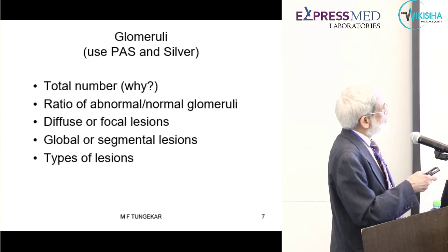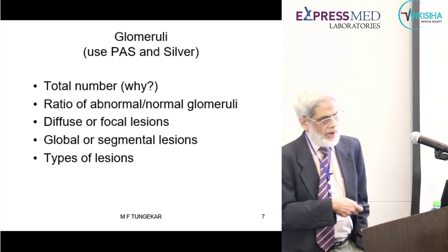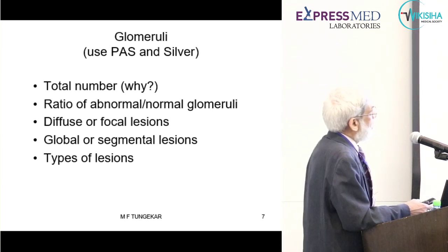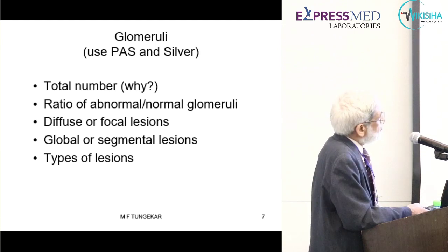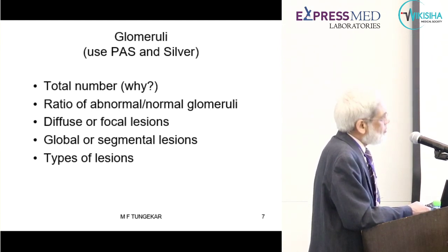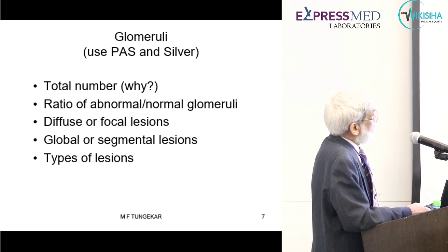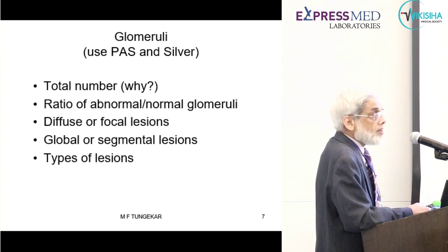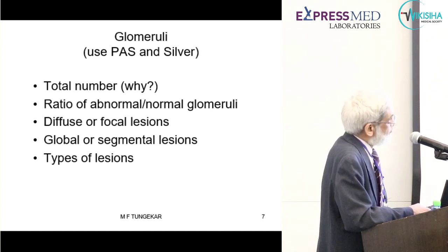And also some classification diagnostic protocols, for example, lupus nephritis or IgA nephritis, and many of the transplant biopsies, require a minimum number of glomeruli. You should have at least 20 glomeruli for lupus, though you don't always get them. That's ideal. For IgA, the recent Oxford classification says 10 glomeruli. Some conditions can be identified with a lesser number of glomeruli.